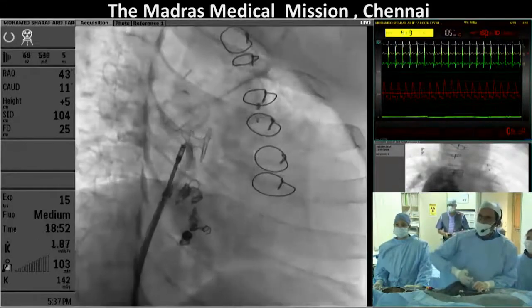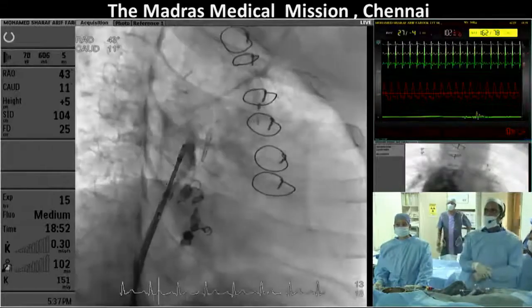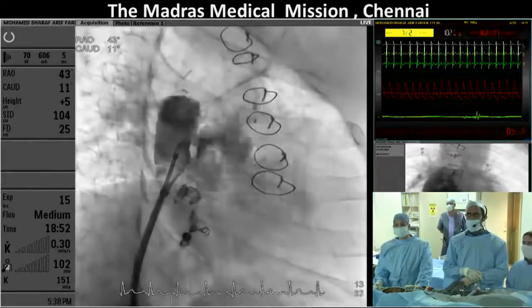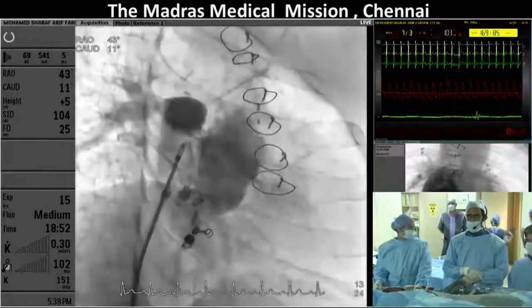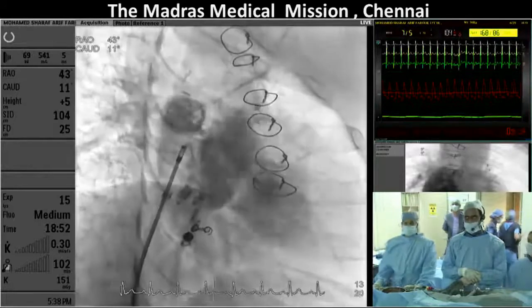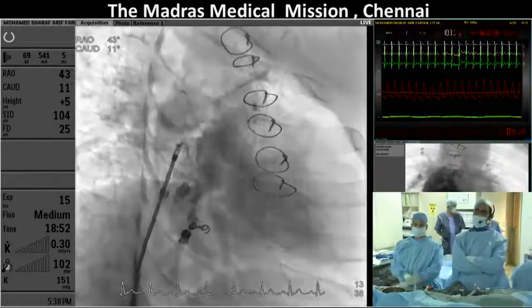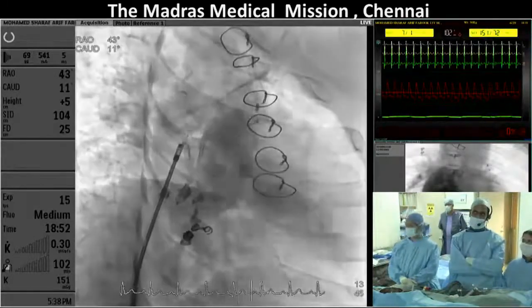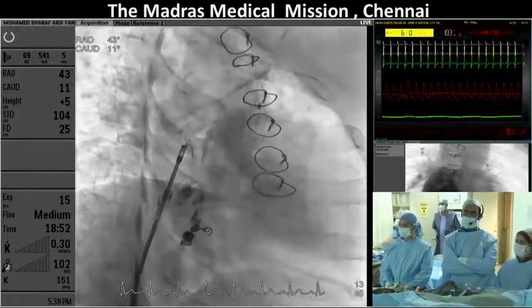We're about to go back to Frankfurt, but the only comment I would like to make is that this is a brand new procedure. It's going to be unpredictable precisely how devices like this are going to behave. They're going to behave differently in low flow versus high flow situations. And the only way for the field to know how big a device like this should be is through a trial and error process. And I don't really think there's any other way to figure out how best to do this.